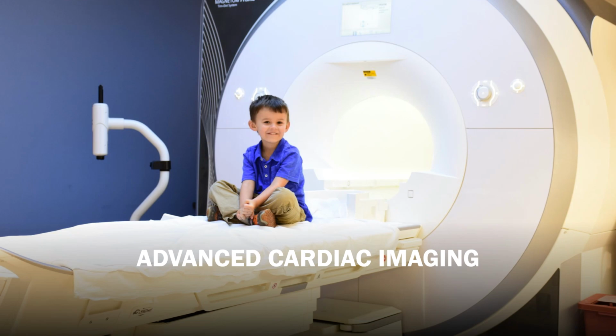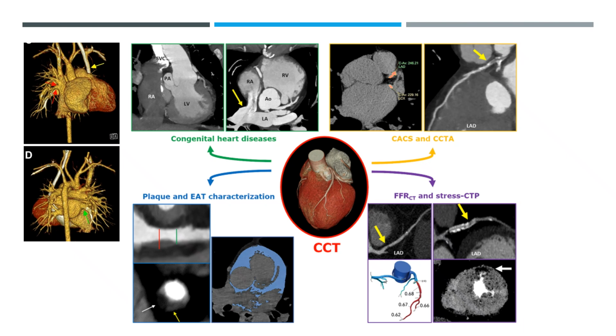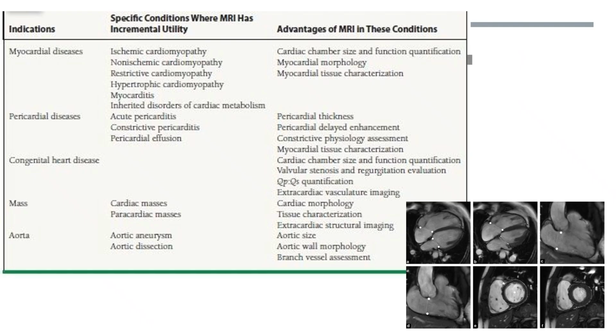In addition, other advanced cardiac imaging modalities are available. We might need to do a cardiac multi-slice CT scan for the patient, which is very good in defining the extracardiac structures and has the advantage of possible 3D image reconstruction. Also, the CT scan is very good in defining the coronary anomalies and is very good in defining calcifications.